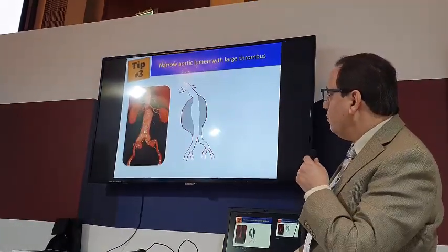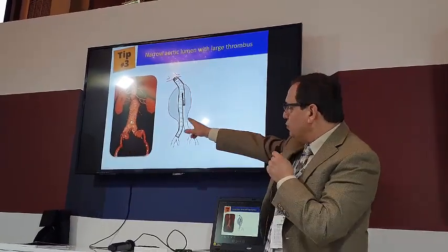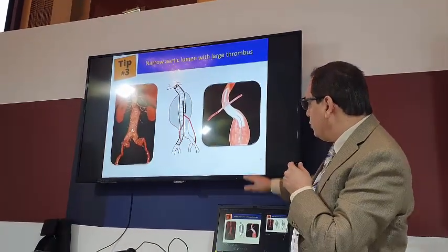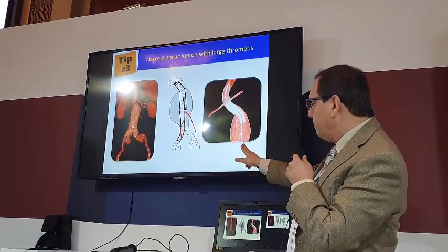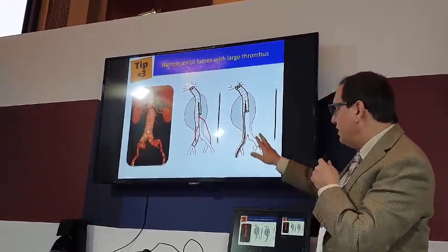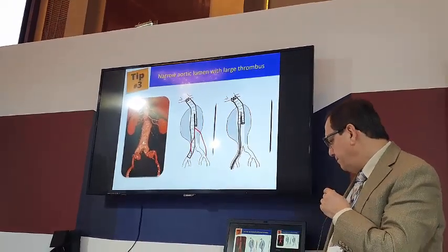The third tip. What if you have a narrow aorta? You have a large thrombus and you end up with a very narrow aorta. If you deploy the device completely, it's going to compress the contralateral limb, and it will be very hard to cannulate. In a better situation, you wait until the contralateral limb is released. Don't deploy the ipsilateral limb completely, so you have space here to go and deploy the contralateral limb. If you have a narrow aorta, deploy the ipsilateral only partially and leave the contralateral limb open.